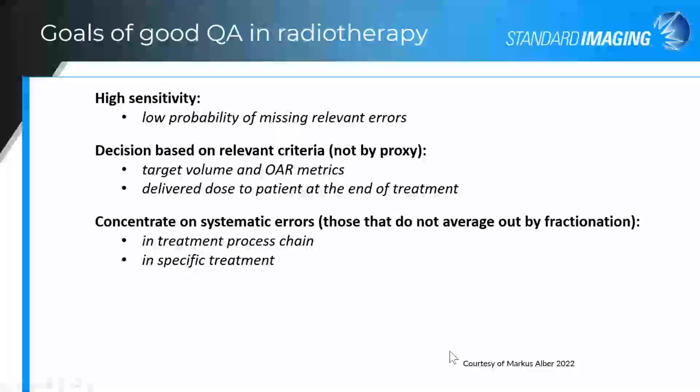We want to concentrate on systematic errors, and then as well, a method with high specificity that does not cause excessive false alarms.